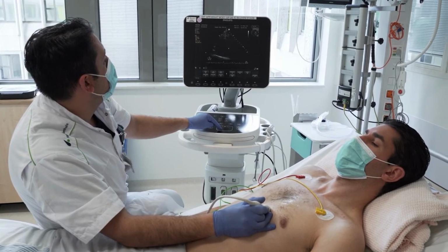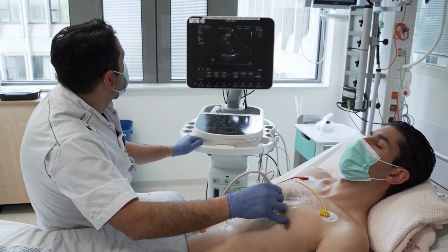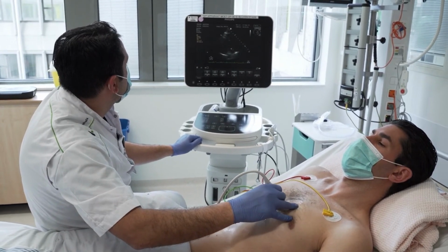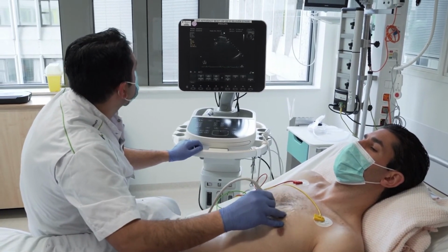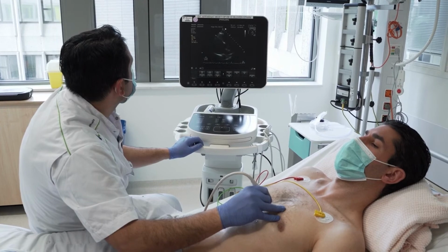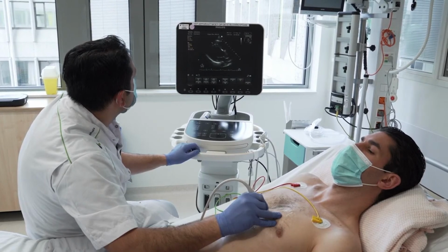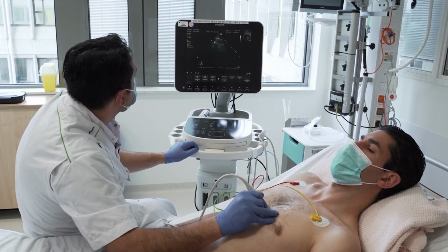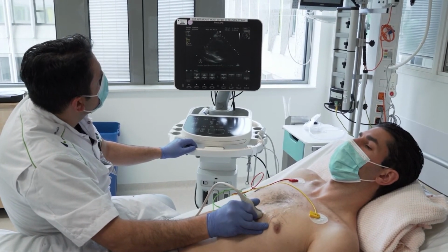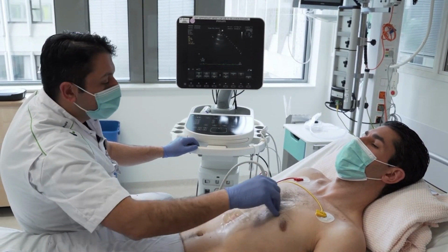It is not uncommon to get lost in the parasternal short axis view, so when you get lost you always go back to the long axis. Maybe you can show that, Sakir. Yeah. So in this case we just try to find the long axis again, which we have found now. And from here you can continue your axial views if you rotate 90 degrees. But this can be quite challenging.